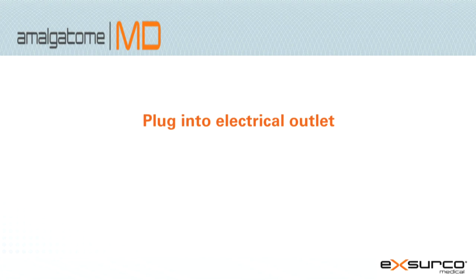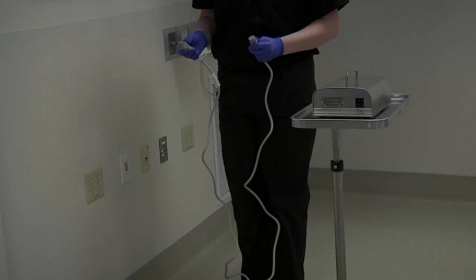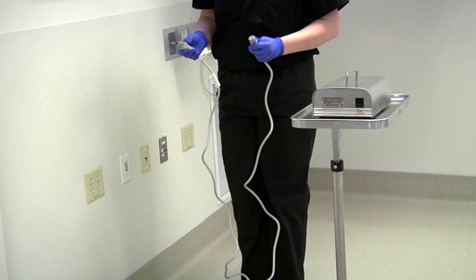Plugging in the Amalgatome MD to the electrical outlet. Place the Amalgatome MD power supply on a table or cart outside of the sterile field. Make sure it is placed on a sturdy, safe surface to protect from damage or fall.